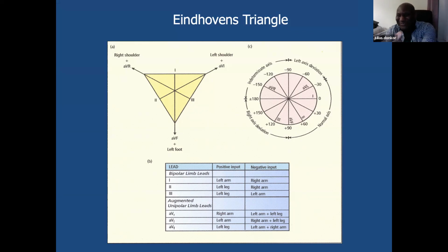But I know St. Jude, I think it came from St. Jude actually. St. Jude actually brought this. Is that right, AJ? When you're doing 12-lead ECG pacing, LV, RV pacing to change the 12-lead to see if you can actually optimize biven pacing based on whether the QRS is narrowing.